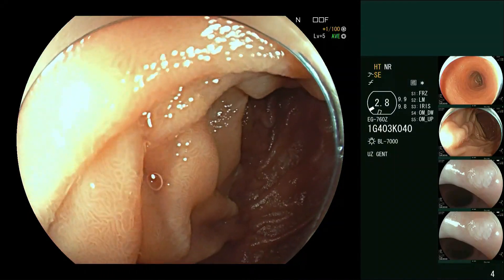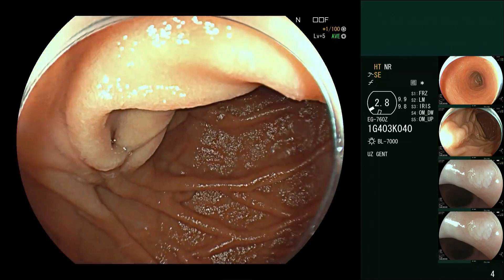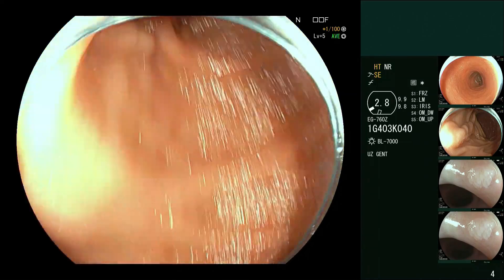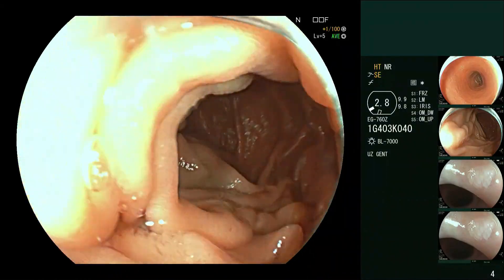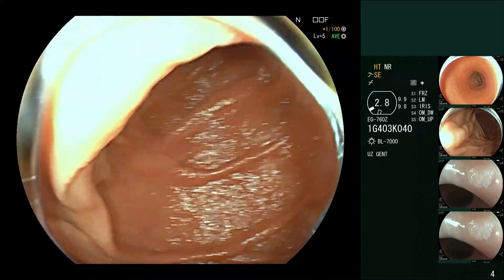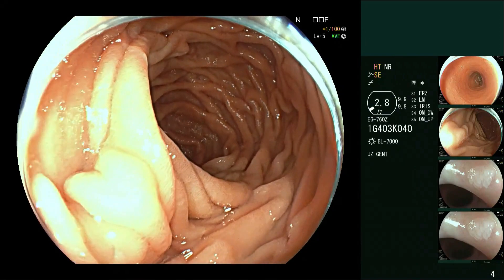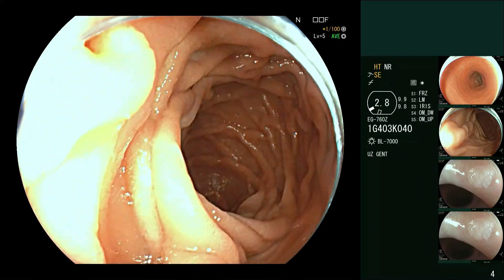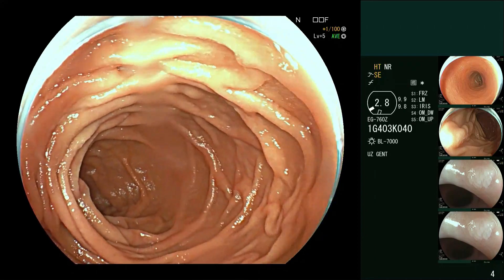If you come back like this, maybe you'll see the papilla, maybe not. In this case we were not lucky. When I was looking before, you could see it quite nicely by pushing in. To get your position better in the second part, you need a bit of clockwise torque, then extend and have a look — and maybe we'll be able to see it from there.